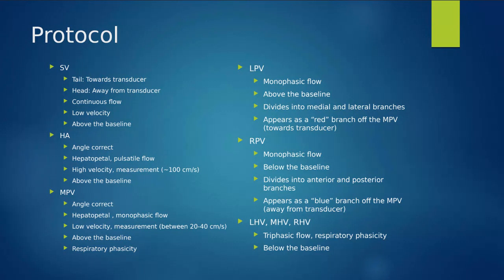We are going to see nodular contour, meaning that border of the liver is going to start to become a little bit lobulated. We're going to see coarse echo texture, so the liver itself is going to start to appear more heterogeneous. We know, depending on the age of the cirrhosis, we are going to see an enlarged caudate, and that can lead to IVC compression.